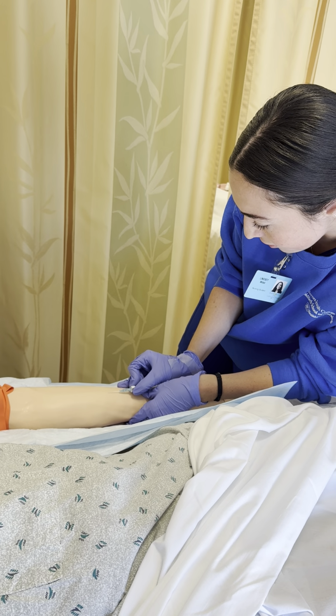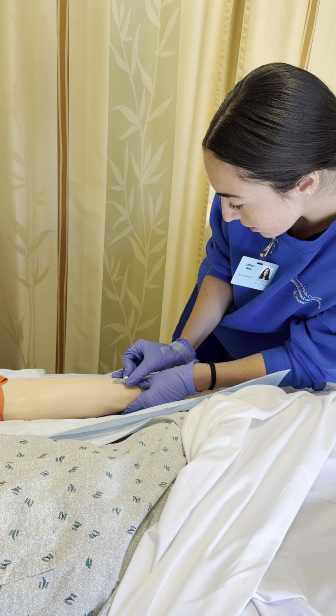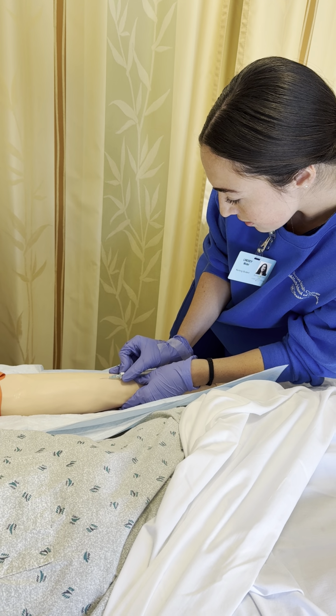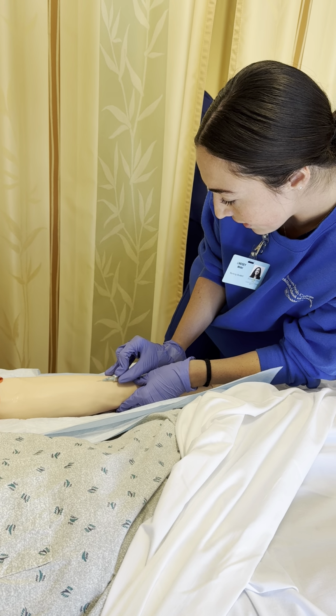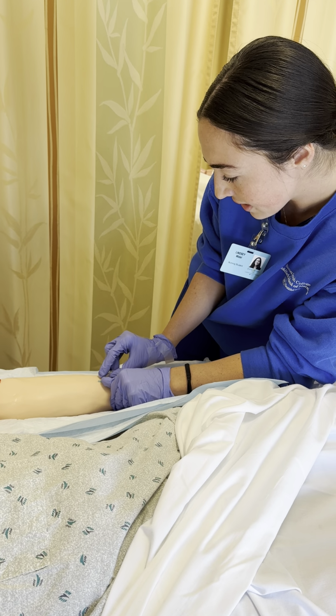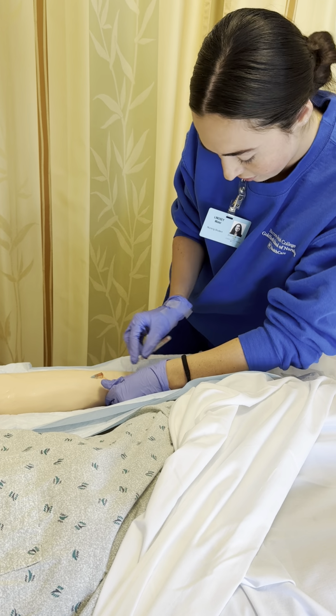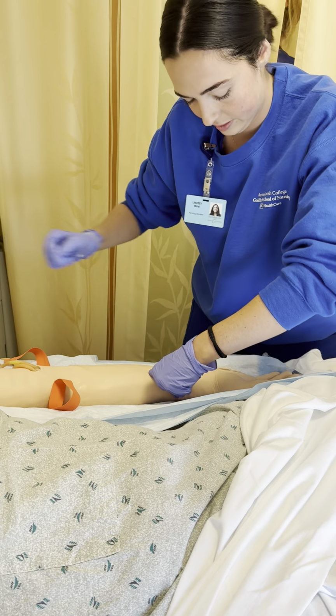And I'm going to wait for flashback. I'm going to advance it. Okay, so I now see a flashback, so I'm going to advance a little bit further, push the catheter off and engage my safety. Okay, I'm going to pop that tourniquet.